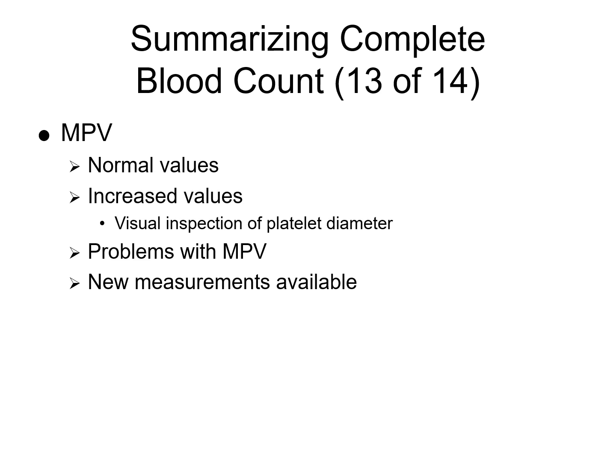There are new measurements available. Some modern analyzers provide additional platelet parameters, such as platelet distribution width and immature platelet fraction as well. These offer a more detailed assessment of platelets, and I'm sure as time goes on, more will come out.